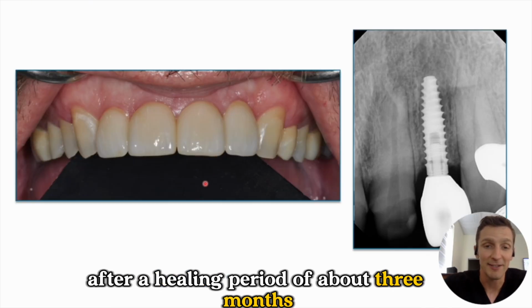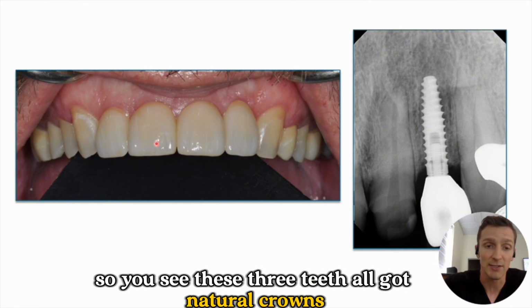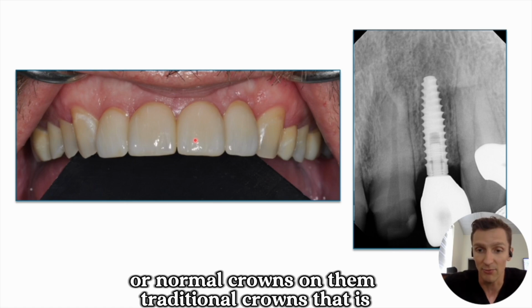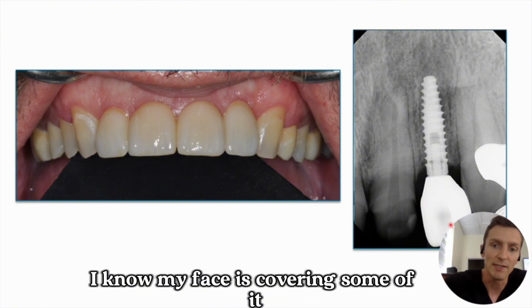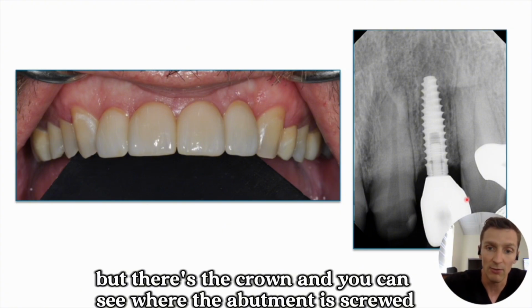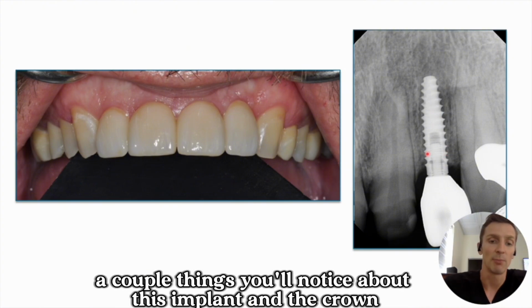After a healing period of about 3 months, we were able to put on the final restorations. So you see these three teeth all got natural crowns, or normal crowns on them, traditional crowns, that is. And the implant tooth got an implant crown. And so you can see in the x-ray, I know my face is covering some of it, but there's the crown. And you can see where the abutment is screwed in, that little screw that screws in internally to the implant itself.